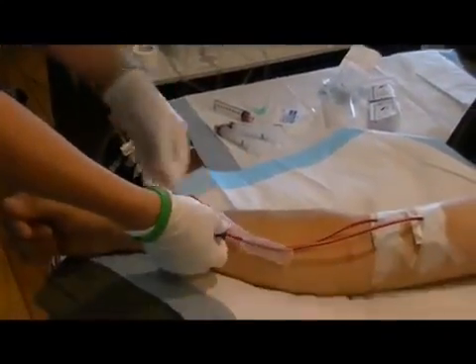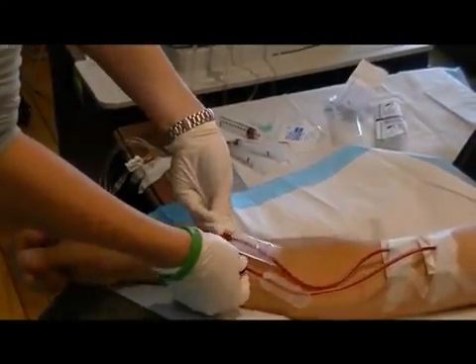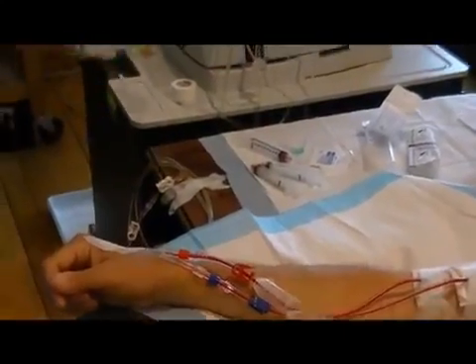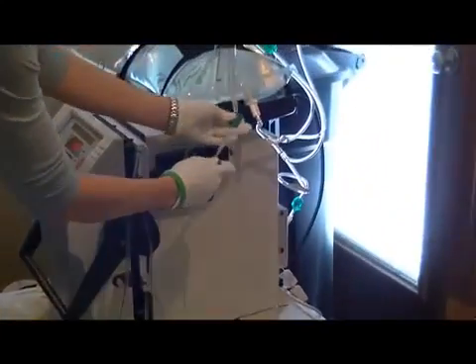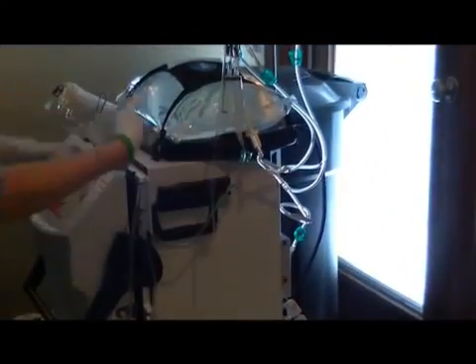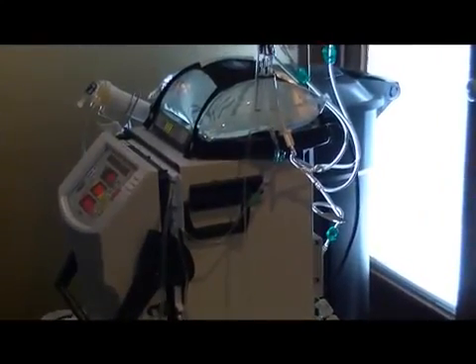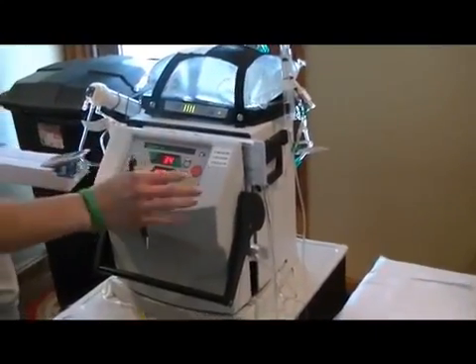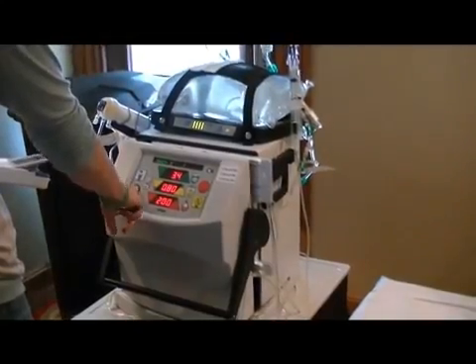You make sure that you've got your arm moved. You open up all of these. Reds and blues are open. Make sure your yellows are opened and your greens are open. And if anything is messed up, you'll get an alarm on the machine during the treatment, well actually as soon as you start. And so now that we've double checked everything and we're ready to go, the machine and everything is set, we hit the green button here to go.